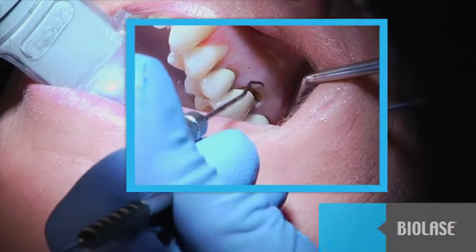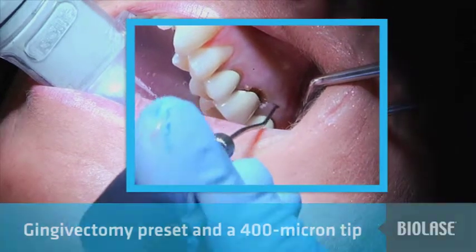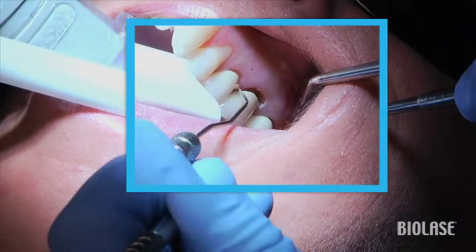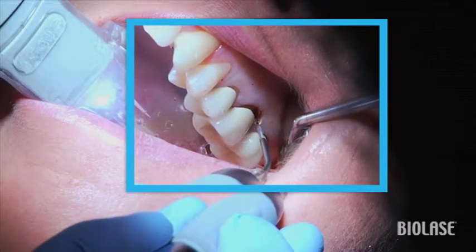In this case, start by selecting the gingivectomy setting and using a 400 micron tip. My patient has a thinner tissue biotype, so before starting, I have decreased the average power setting to 0.7 watts.